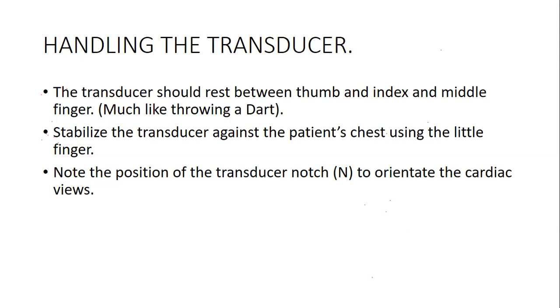Make sure you stabilize the transducer against the chest wall using the little finger. There is a way you hold this, and that should not be a problem for somebody who has been doing ultrasound. Then always ensure that the position of the transducer is oriented to the cardiac views, which I will explain when you're doing this echo.